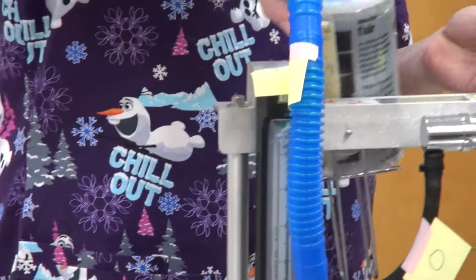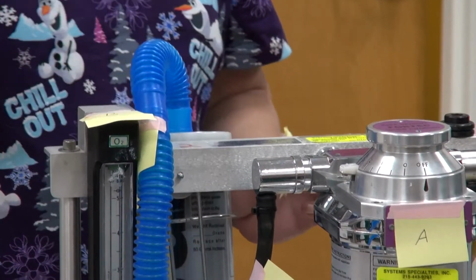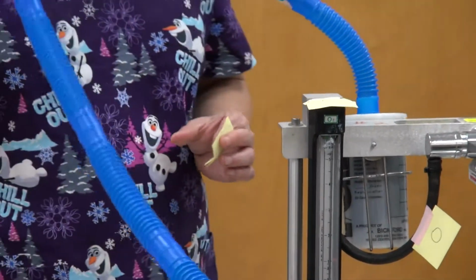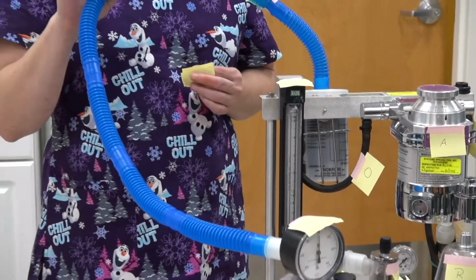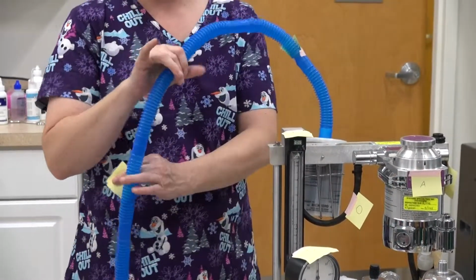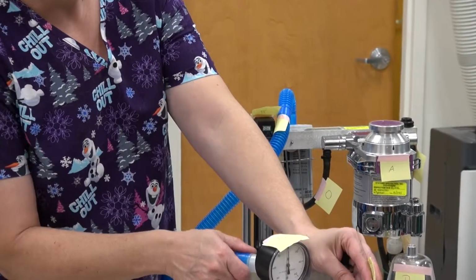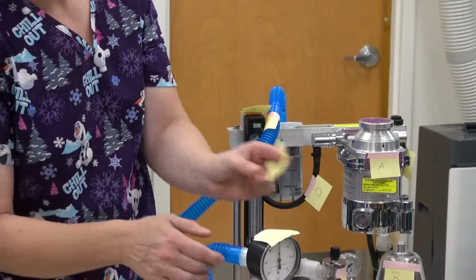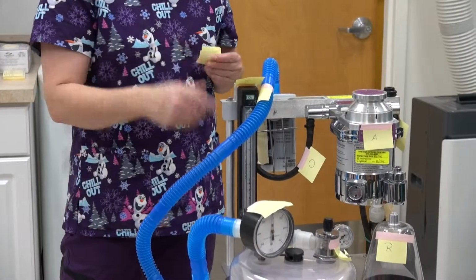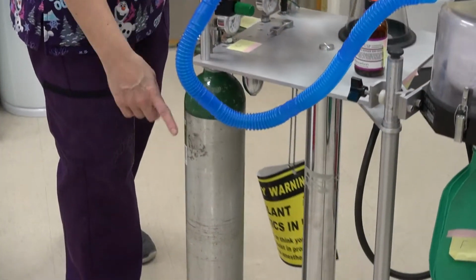Okay. Then what is J? The scavenger hose. Right here, right? This is our scavenger hose, correct? Now, in our hospitals, we can have a scavenger going through either here to a canister, or where else? Going out to the hospital ventilation system. They might have their own in-house scavenging system, correct? K, oxygen tank. The oxygen tank right here.